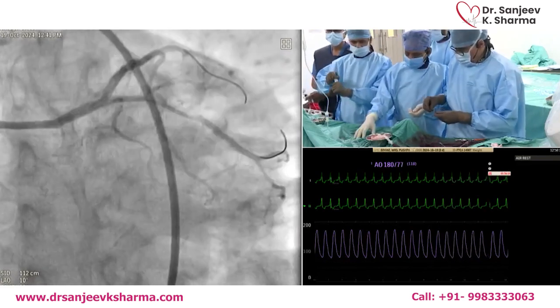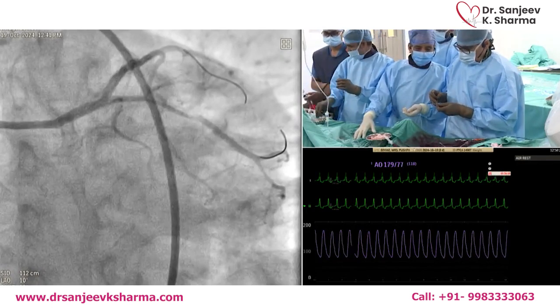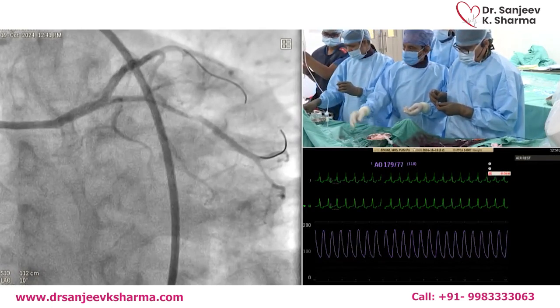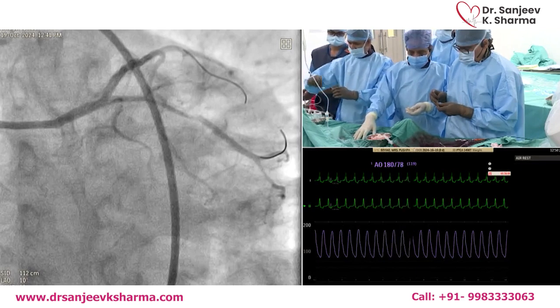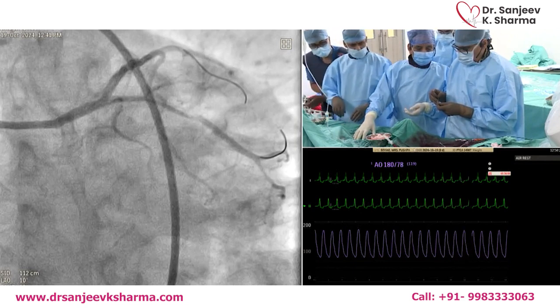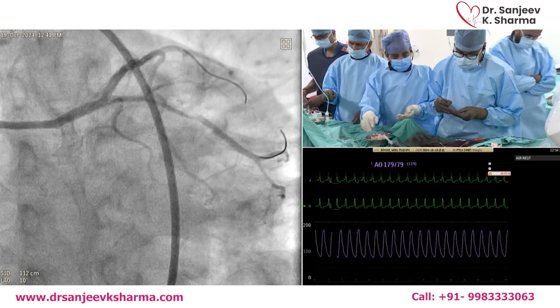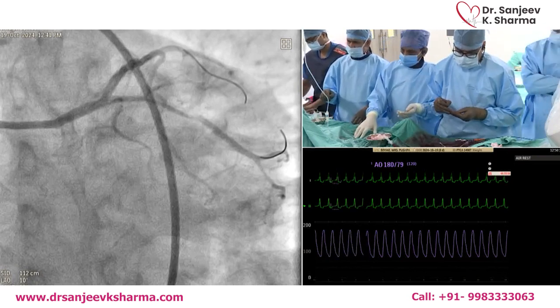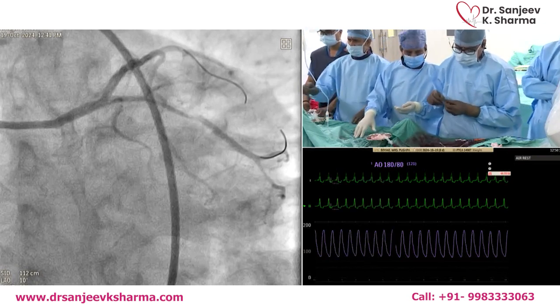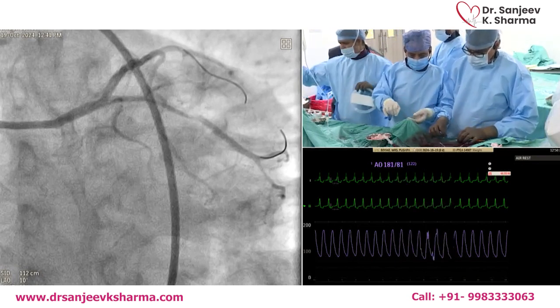And we see, coming back to the live case now, this is a great result with the dilation. And indeed, the most important calcified 360 degrees was in the distal left main right before it bifurcates. So that exact area, you saw right before the balloon had a little bit of a spot there that you can really pinpoint that all these devices were really needed, because after that it wouldn't have given with a regular balloon, no question about that.